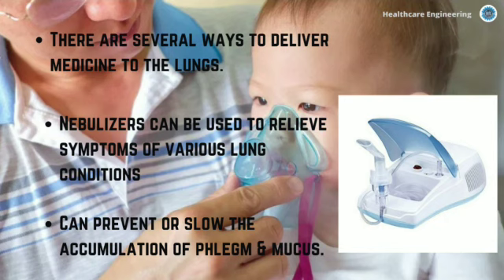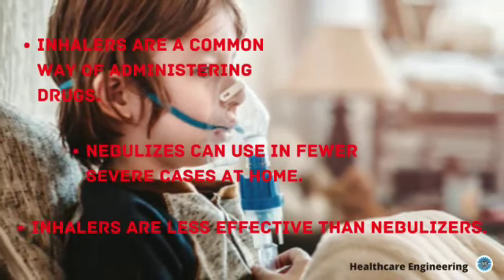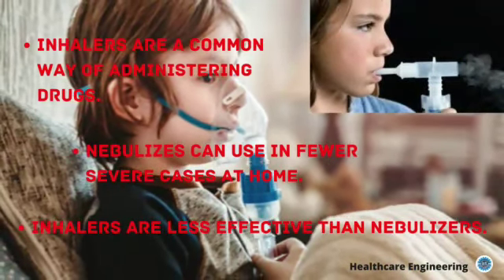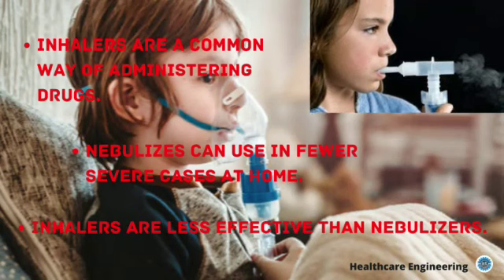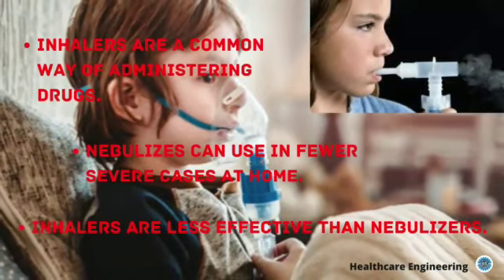They can also prevent or slow down the accumulation of phlegm and mucus. Inhalers are a common way of administering drugs, but nebulizers have distinct advantages in several situations. In an emergency situation, such as when breathing becomes difficult and a high dose of medication is needed, or when antibiotics are needed against an infection, nebulizers should be used. In these cases, it is done by paramedics or hospital staff.